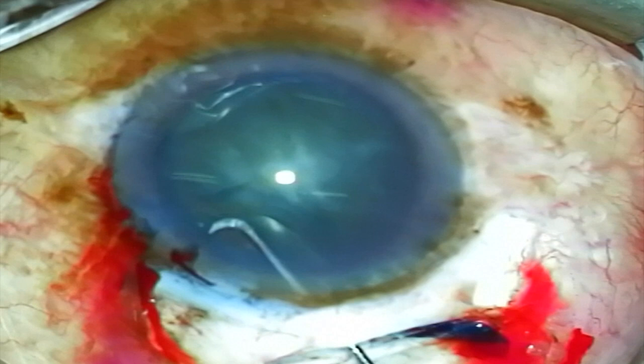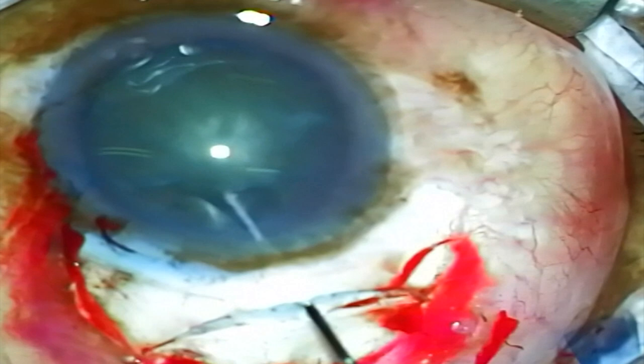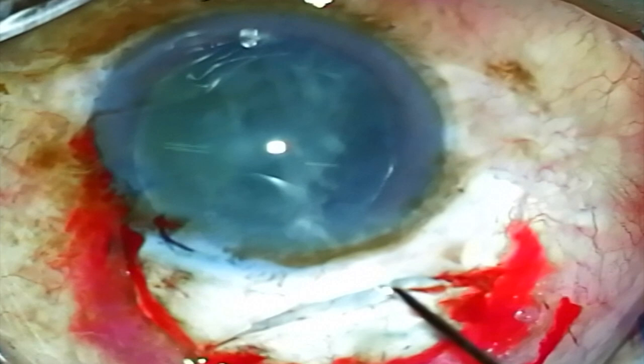This next case is another brunescent lens but proves slightly more difficult to rotate into the anterior chamber. Here again I'm using the balanced salt solution on a Chang cannula to perform hydrodissection, and then using that Chang cannula while injecting BSS to try to rotate the lens. This lens is less dense than the previous ones and the Chang cannula is cutting into the lens more so than rotating it.